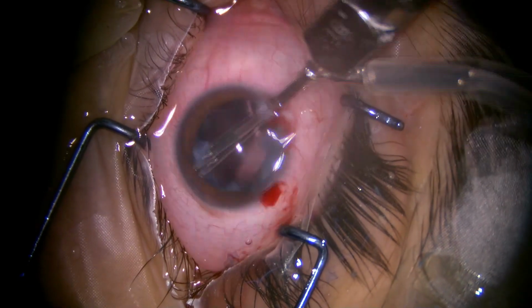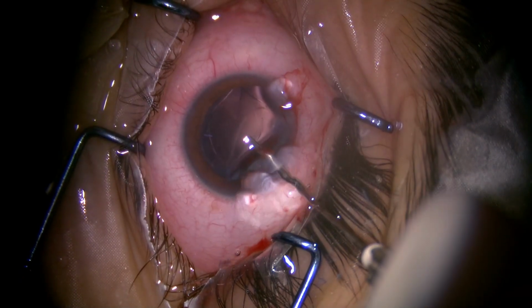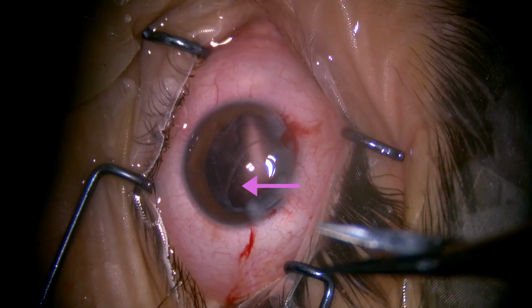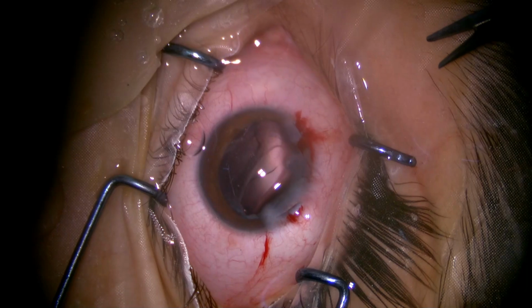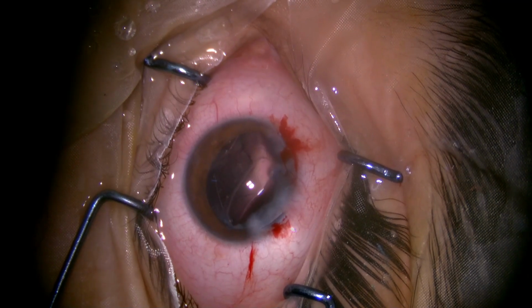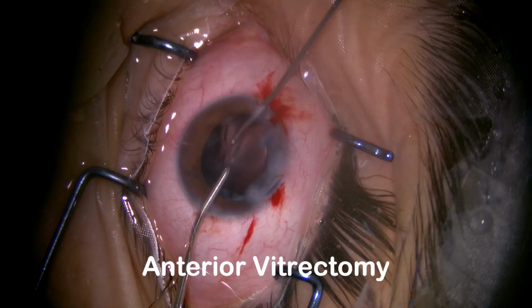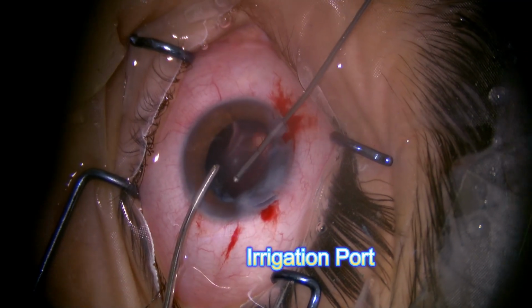Here we notice that the cortical matter is not being easily aspirated using the Simcoe cannula. After careful observation, vitreous strands coming into the wound are seen, which are cut with a Vannas scissor. Side port is being made. Now the anterior vitrectomy is completed using a 25 gauge vitrectomy cutter.